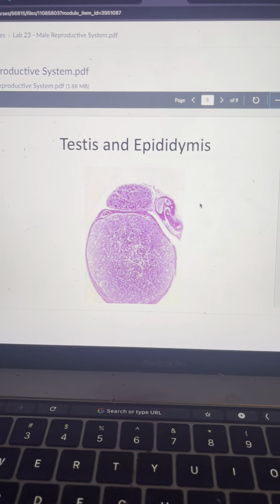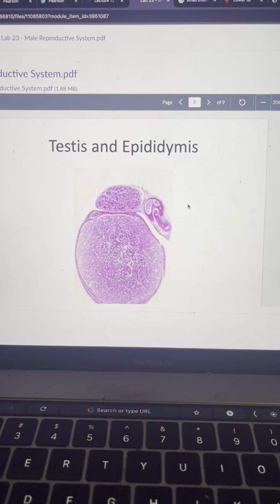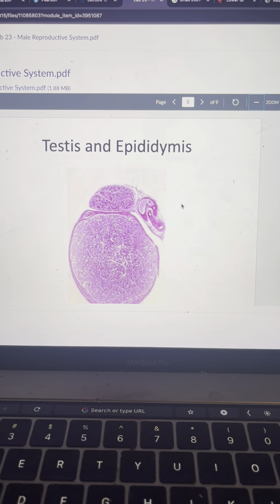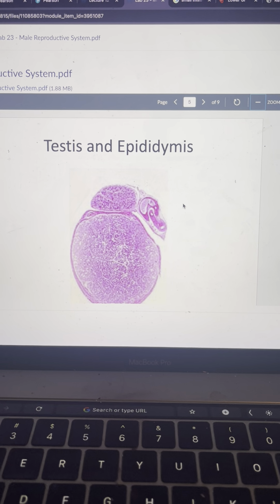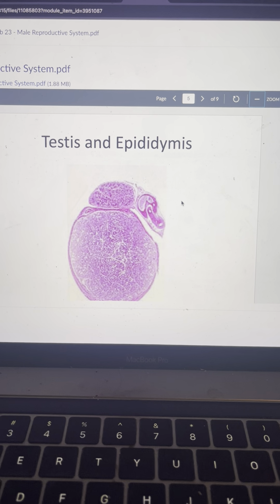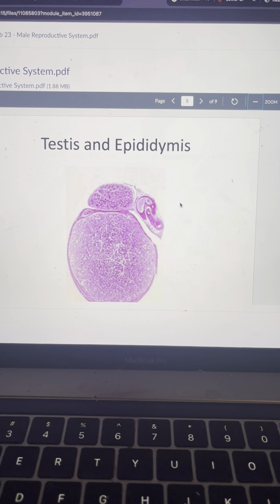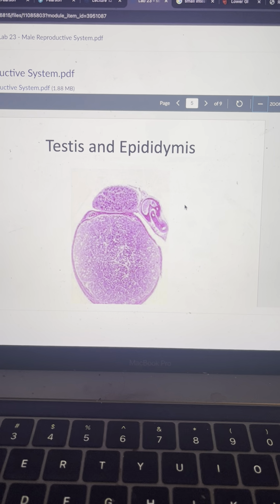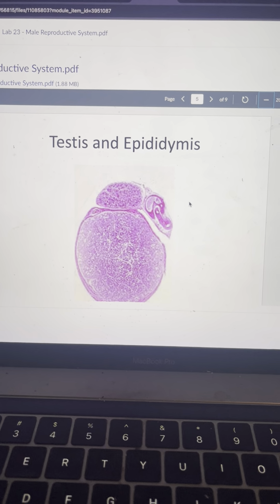Especially with histology, noticing tiny differences in pictures is really going to help differentiate different structures. The colors also really make a difference, because when you look at everything in histology, everything is stained in the same color. The only thing that helps us differentiate which structure is which is the shape of it. So I color coded everything, so you can see little tips and tricks for how to differentiate certain structures. Without further ado, I'll get that going.